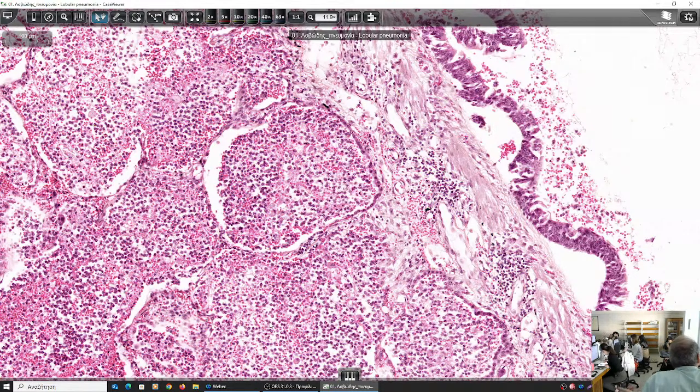They do not have air. What has happened? We had Streptococcus pneumoniae entering the lung. It secretes toxins. It causes damage. So this stimulates the inflammatory process. We have increased flow of blood in the area. That's why we find the microvasculature of the region, that means the capillaries in the intra-alveolar septae, congested, because due to the secretion of vasoactive amines, mainly histamine, we have an increased flow of blood to the damaged area.